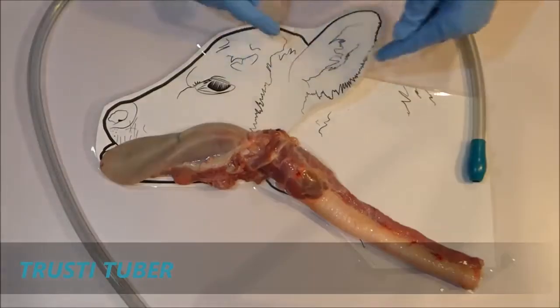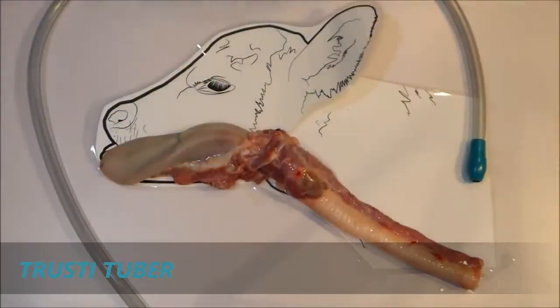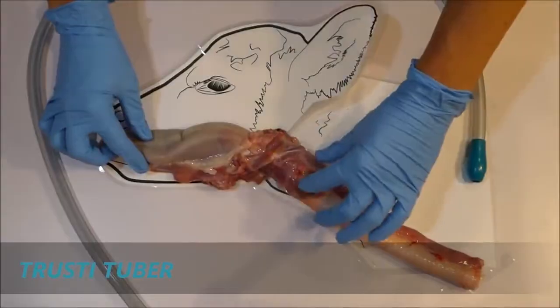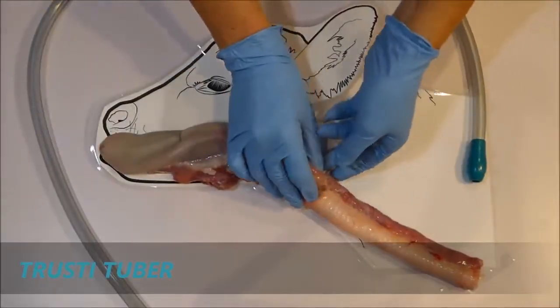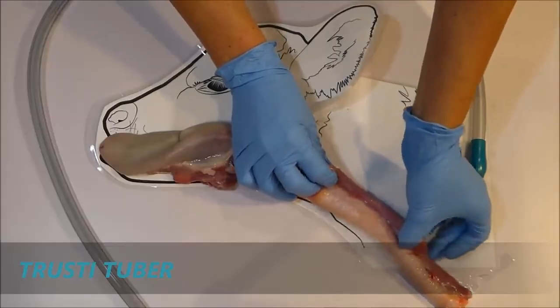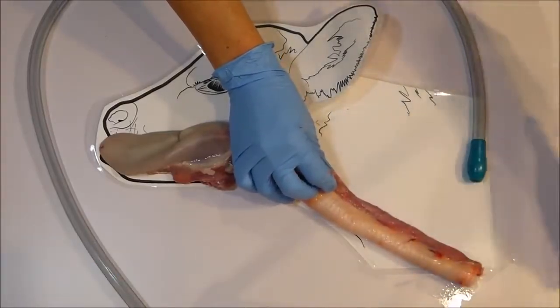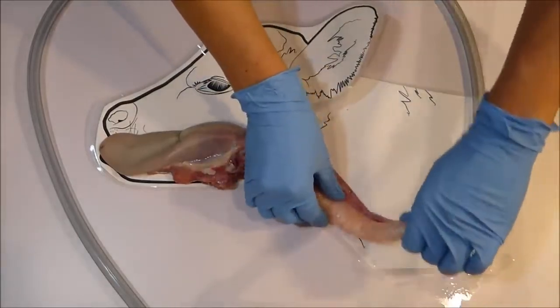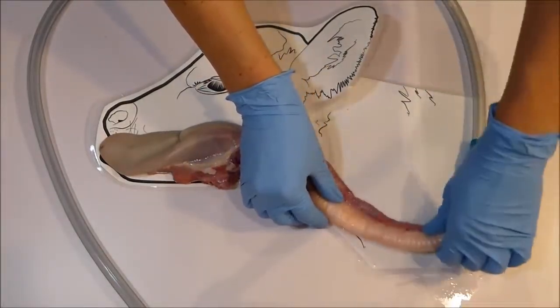Behind the parts is an outline of a calf so you can see where they are positioned. Here we have the tongue, then the throat area. This soft, stretchy, collapsed tube here is the esophagus which travels down to the stomachs. Just below this is the airway, a semi-rigid tube which lies very low in the neck.